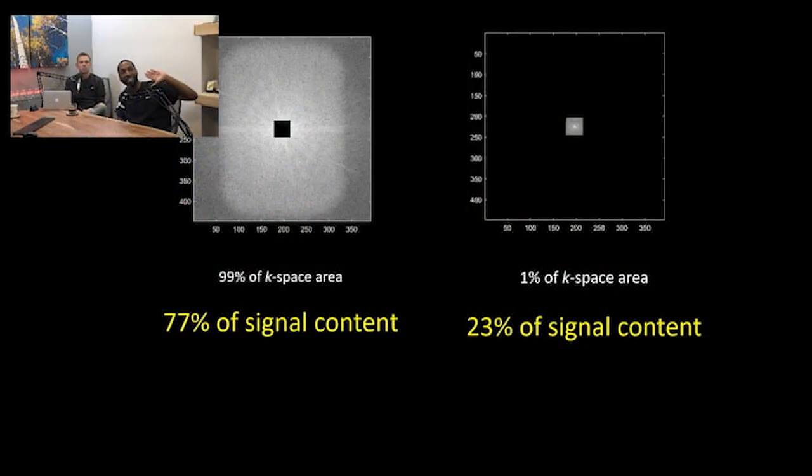When I look at Kspace, as in that diagram you showed in the very beginning, with a very bright center and a lot of dark space around it, it's like a puzzle, right? You take that piece of the puzzle and bring it over, and that puzzle represents the coordinates for the image. You're taking pieces from Kspace and plotting your image according to the puzzle pieces that you have, right?